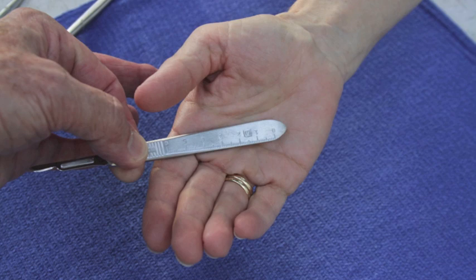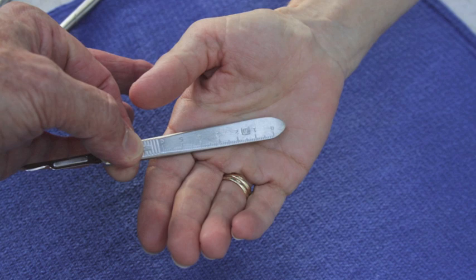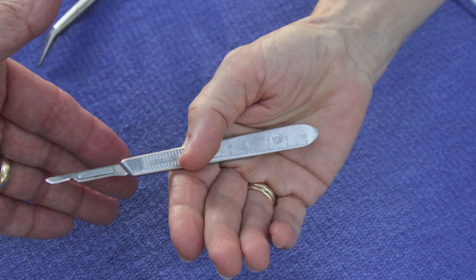Notice the relationship between the assistant's hand and the surgeon's hand. The assistant is holding the scalpel in the way that was presented in the previous photograph. In this photograph, notice that the assistant is placing the handle into the palm of the hand. Once it is placed, the assistant will hold on to the instrument until the thumb of the surgeon comes down to grasp hold. At that point, the assistant is free to move their hand away. Do not let go of the instrument until you can see that the thumb is now down on the instrument and grasping it.